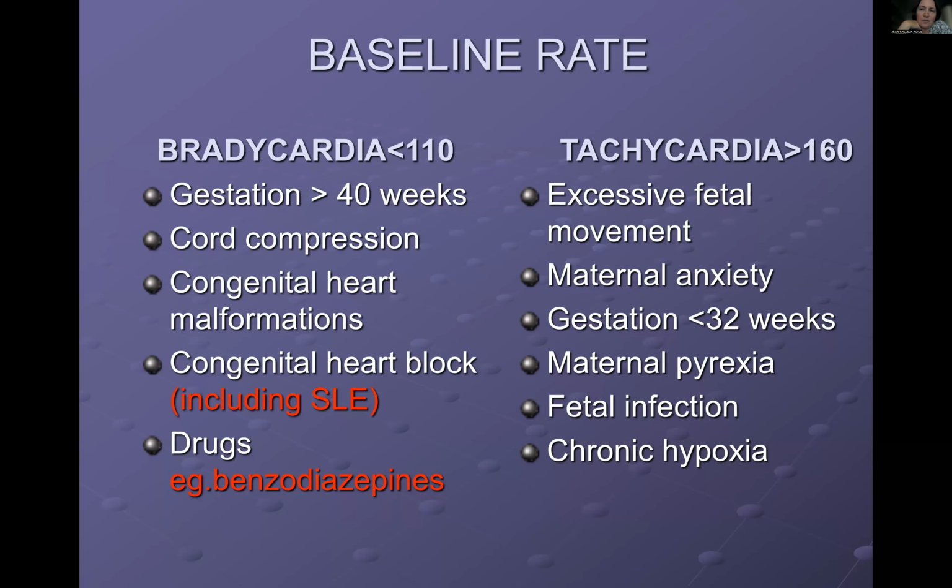Tachycardia, on the other hand, with a baseline rate of more than 160, as I said, baseline rate, so not just acceleration, could happen if there's excessive fetal movement. And again, that's why you have to look for at least 20 to 30 minutes, right? Because we know that the fetus normally takes breaks, and so even if the baby is moving, it will not continue moving excessively all the time throughout the whole labor. And we also know that maternal anxiety can also make the fetal heart rate increase.